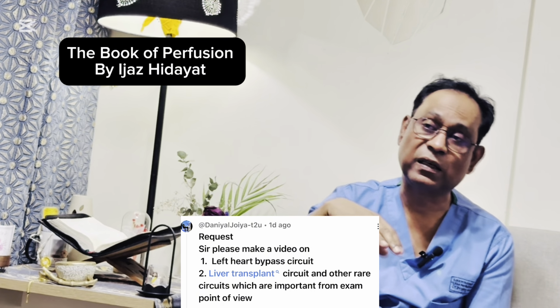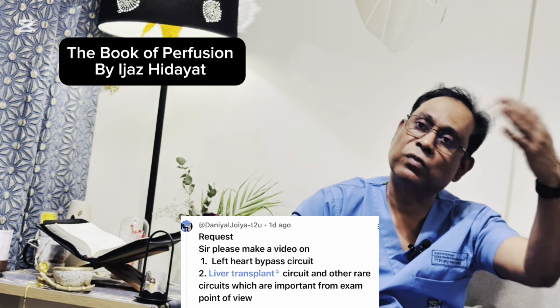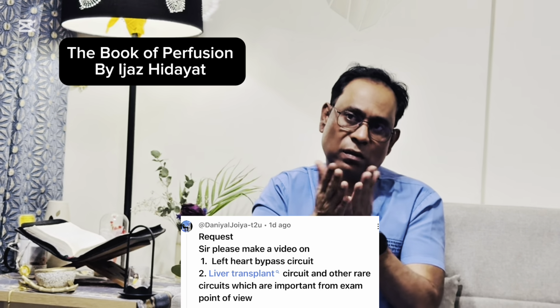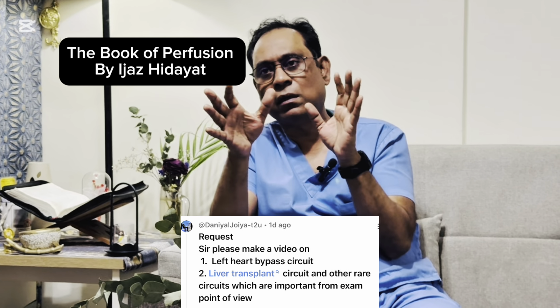So we are bypassing and providing lower limb perfusion of the body, and there is no need for the oxygenators. Mostly we use a centrifugal pump, which is dependent on preload and afterload. The target is to maintain the saturation of the patient and the mean arterial pressure, and you can give a pulsatile flow, because you are not getting 100% flow through it. The lower limb perfusion can be a 2 to 2.5 liter flow, with ejections. So this is the left heart bypass.